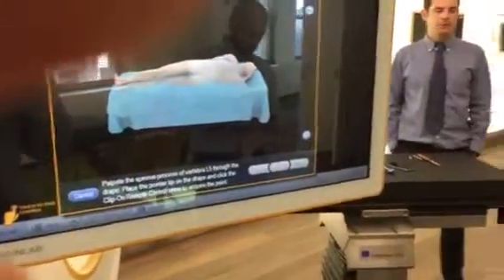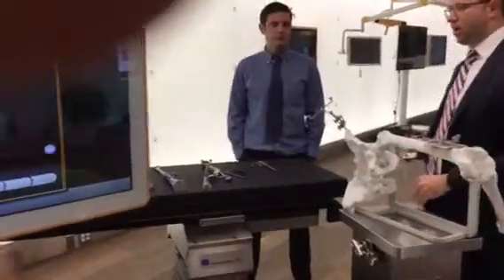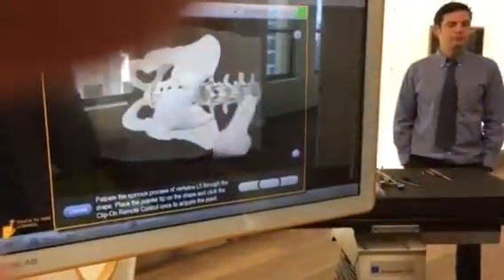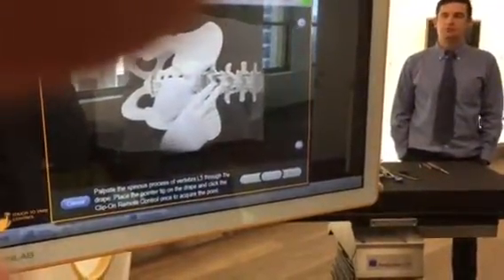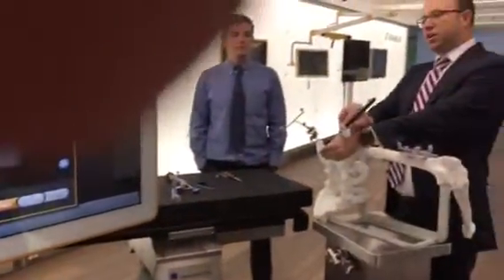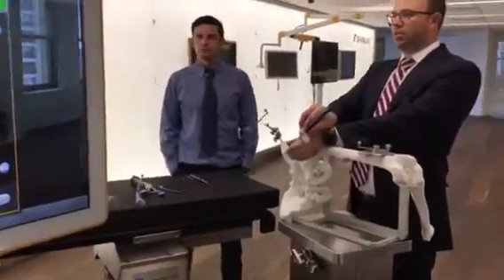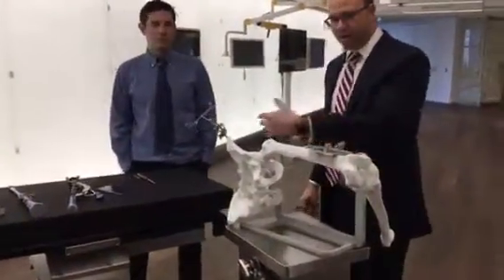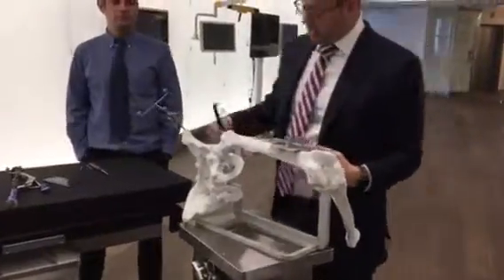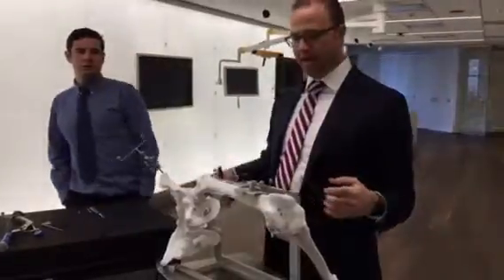But that does require that I take a single point on the back of the patient to start the software. So I'm going to locate L5, I'm going to take my pointer at L5, and I'm going to take a single point. Then I'm going to move forward to the ASIS on the upper side of the patient. Take a single point there. At that point I would do my exposure, right? And the patient hasn't had to be repositioned. They're all still in lateral.